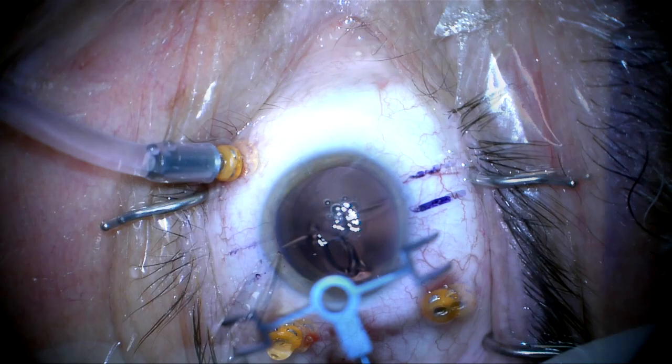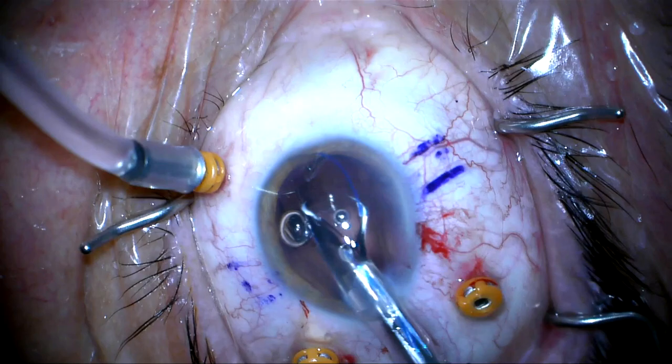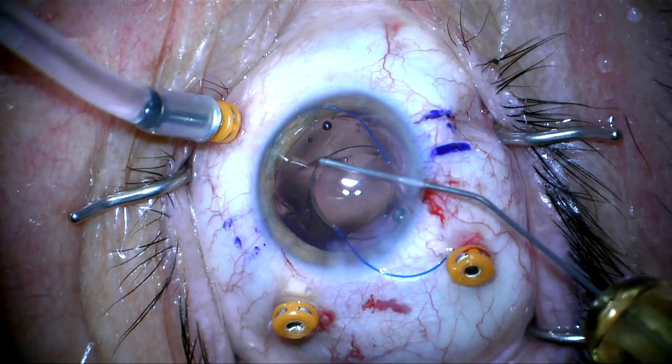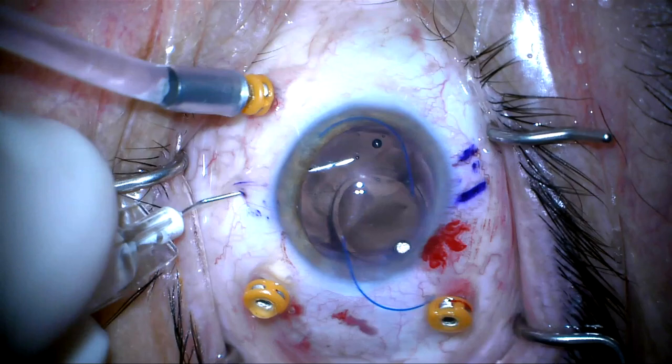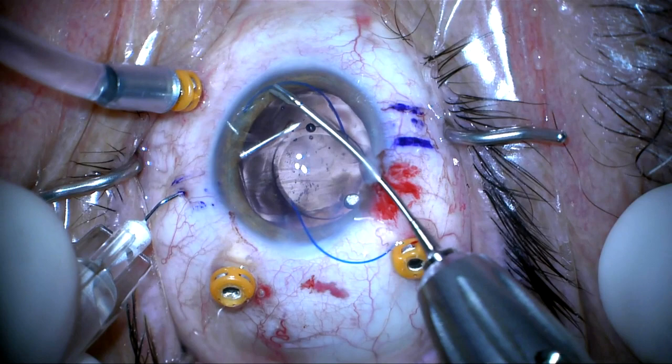The eye is marked with an Agarwal marker. The lens — a Zeiss 602 CT Lucia — is injected into the anterior chamber. Here I'm putting dispersive viscoelastic over the lens to protect the cornea. A 30-gauge needle is passed, creating a scleral tunnel, and the distal haptic is passed into the lumen of the first 30-gauge needle.